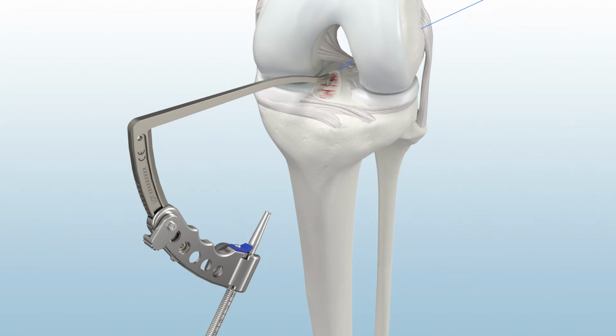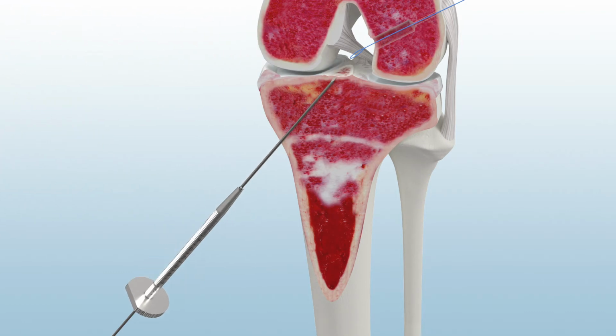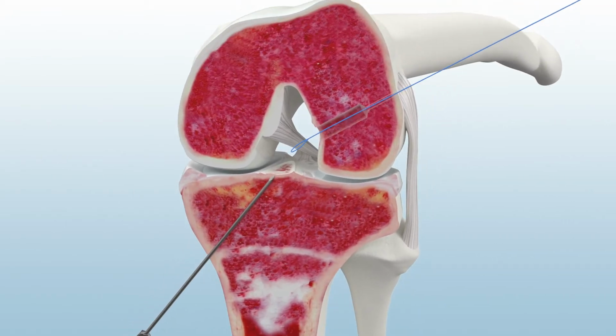Place the tip guide's point at the center of the ACL footprint and advance the guide sleeve firmly against the tibia. Then, advance a 2.4mm tibial guide pin until it meets the tip of the guide arm. Remove the guide from the joint. Then use a constant diameter reamer to ream the tibial tunnel and prepare for graft passing.